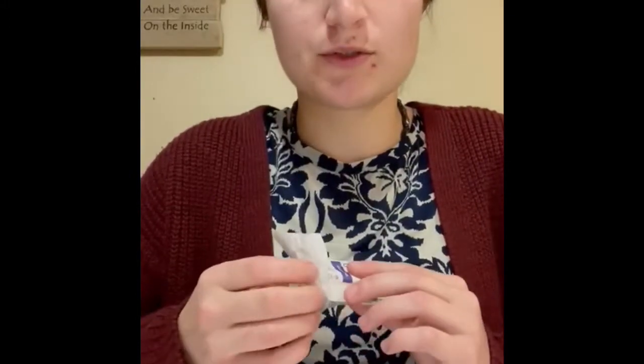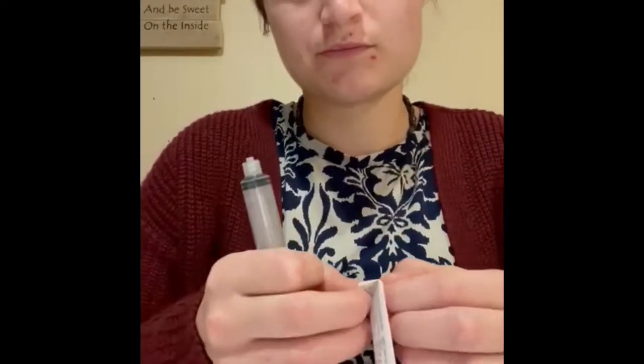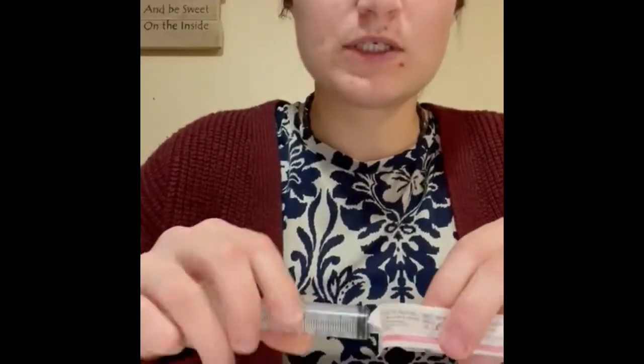Draw my solutions. So I'm going to open this up, take this out. I have my blunt fill. I'm going to attach it.